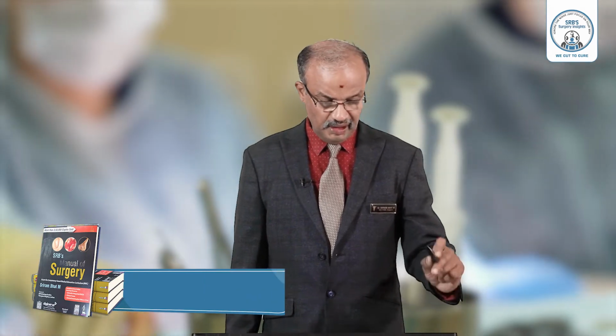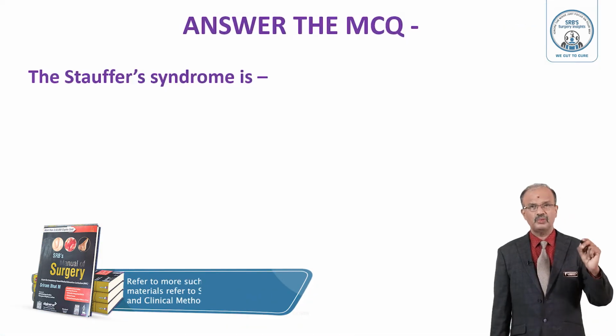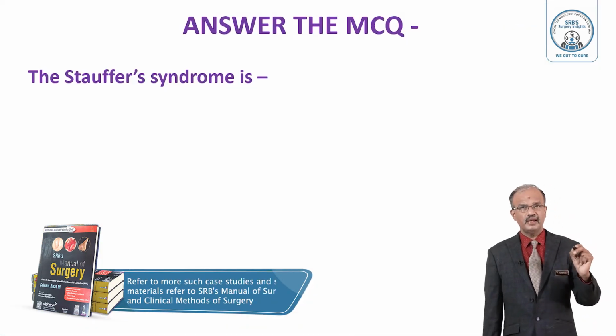Dear students, today we'll discuss imaging, rather CT imaging. That's the standard method for all diseases, probably. Now, before discussing the CT scan, we will go through an MCQ quickly.